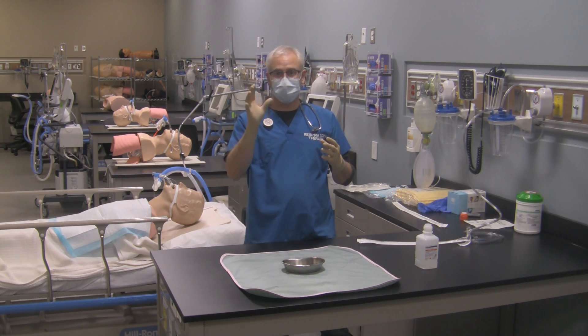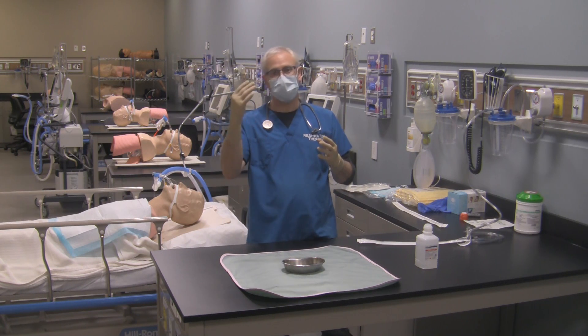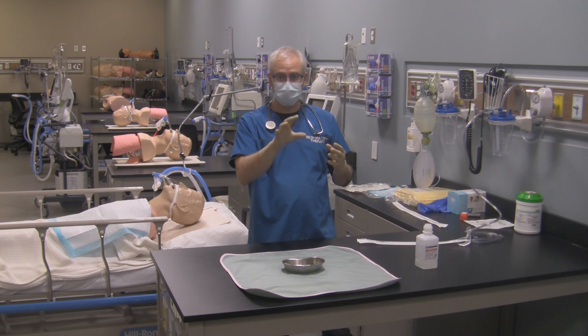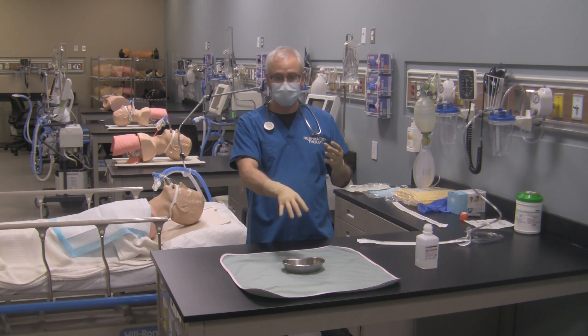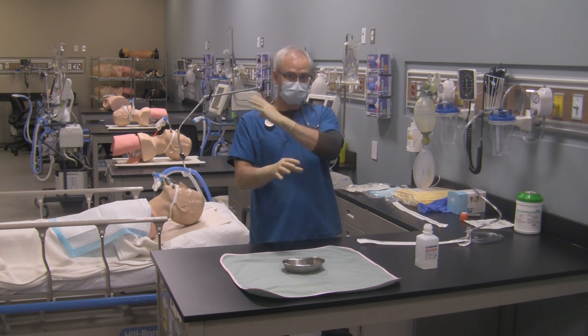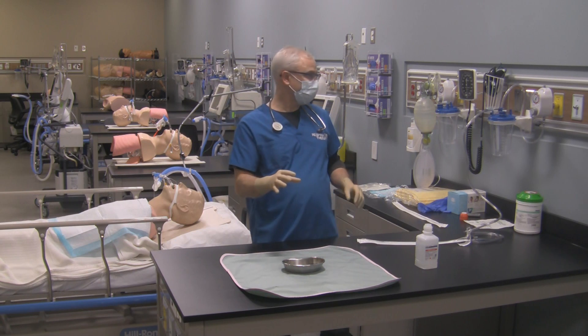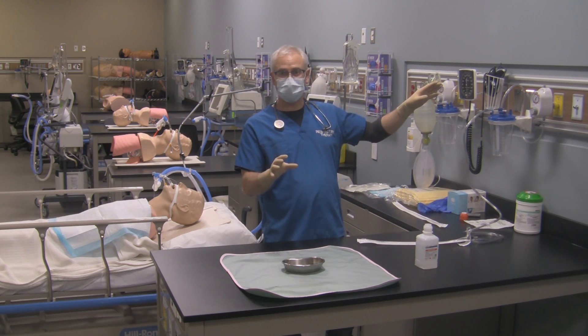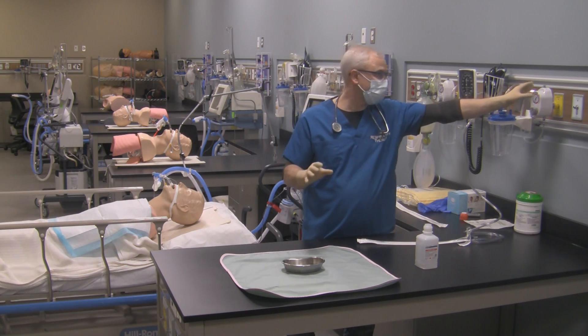For me, I'm right hand dominant, so I'm going to keep my right hand as my sterile hand. That means I can only touch the sterile catheter and sterile field with my sterile hand. Everything else I can touch with my clean hand. So the first thing I'm going to do is turn my suction on and make sure it's set to my appropriate level of 120 for the adult patient.